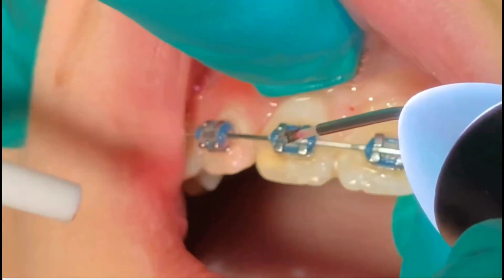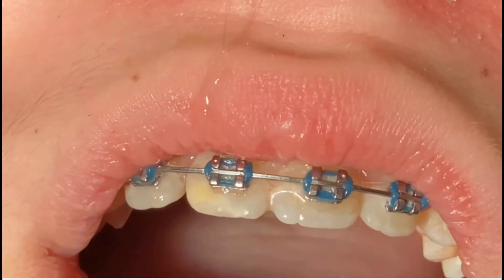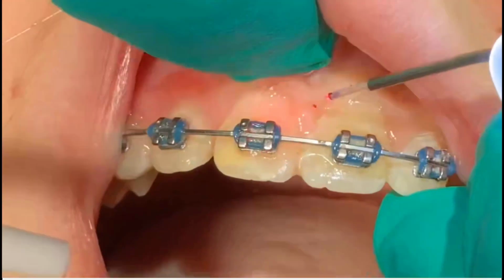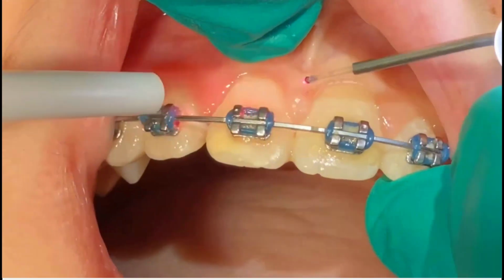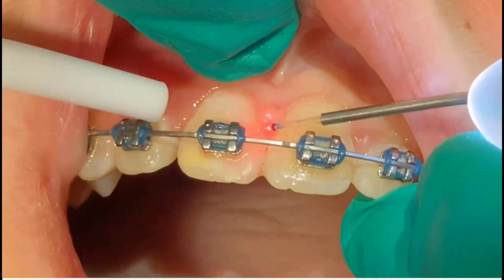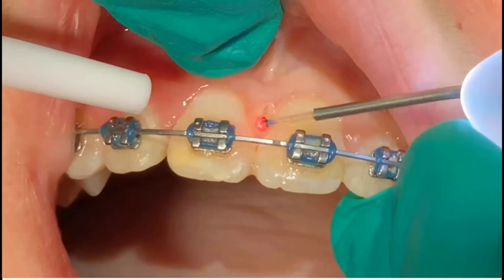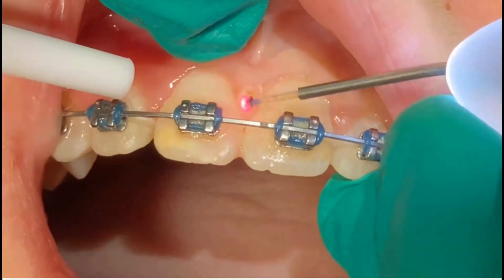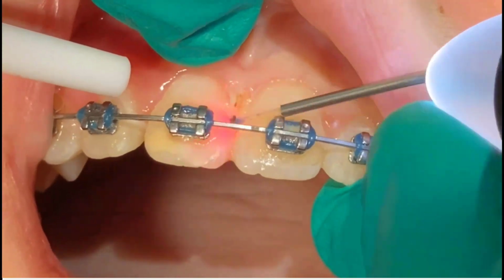Right here in the center, turn to me a little bit. Now I'm going to do a little gingivoplasty. Right, so I'm going to cut the power down a little bit. Now go in a parallel motion, kind of suction right here. Snowplow that because I just want to fillet it or thin it out. But I also have to understand the diode energy is only coming out the tip. So I'm kind of going side to side. I'm just going to thin it out just a little bit to flatten that off.